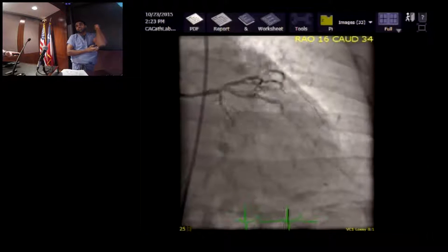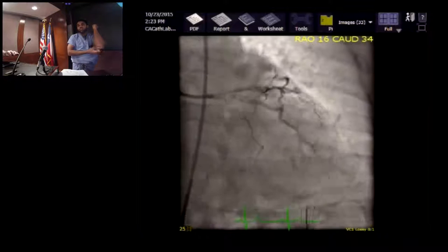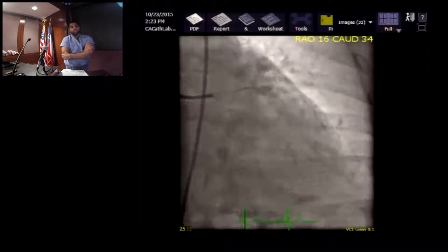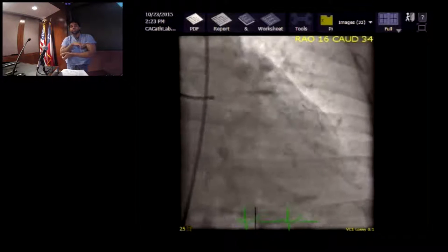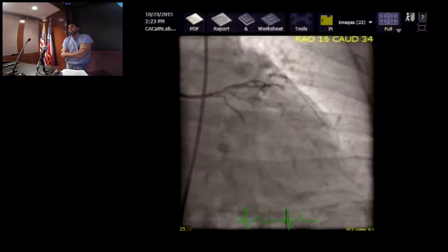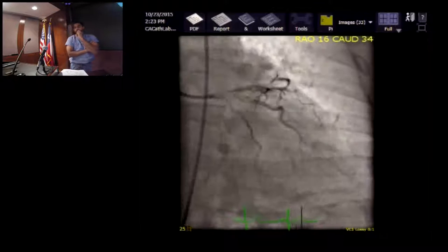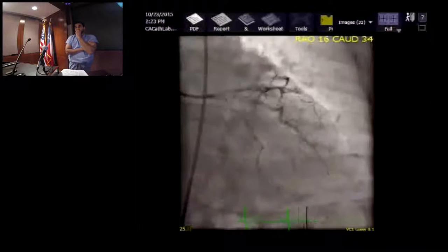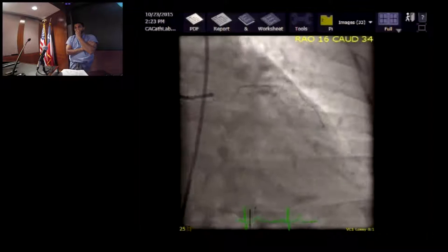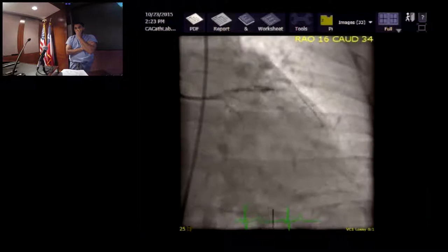Nonetheless, what was very interesting was the lesion which did not seem very significant on angiography, but was significant by FFR. It's a good way of assessing patients where either non-invasive testing is not being done or can't be done. So if this patient had a positive stress test, would you still have FFR? Yeah, if angiographically something looks not significant, you should. Like a large area of anterior ischemia? If it's large, I think I would probably debate.